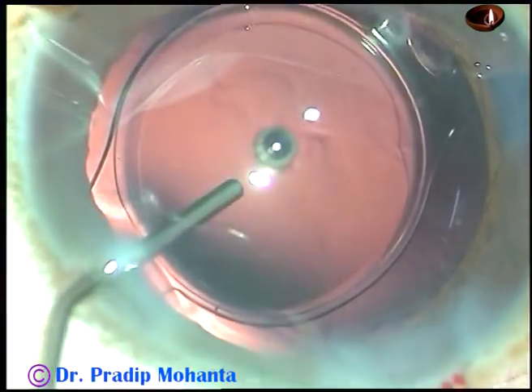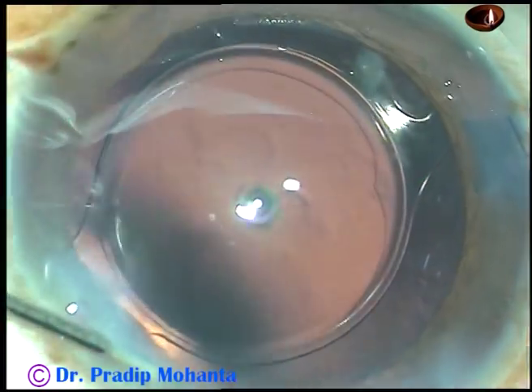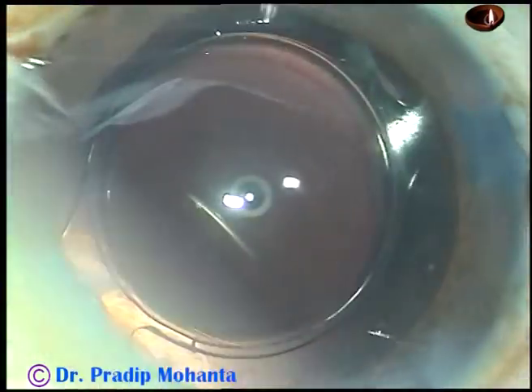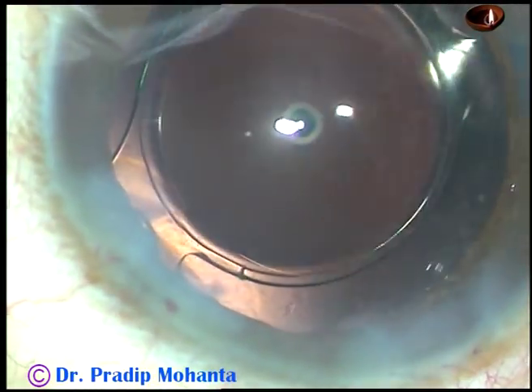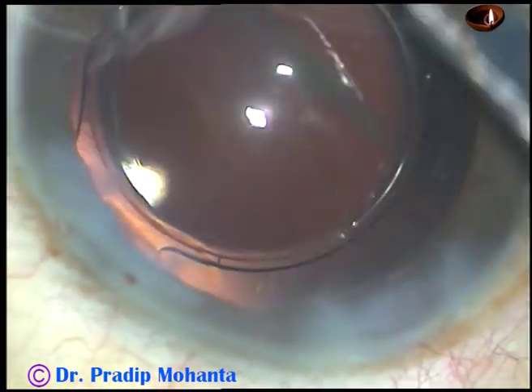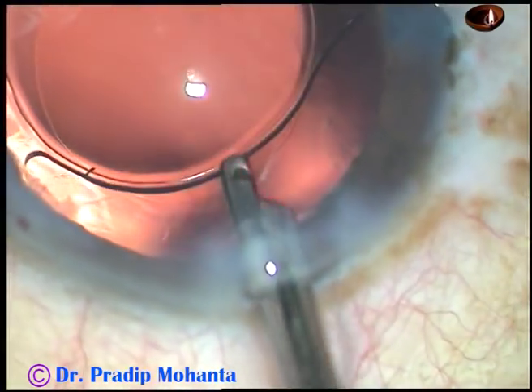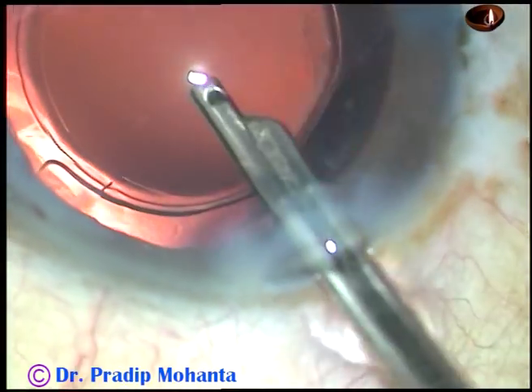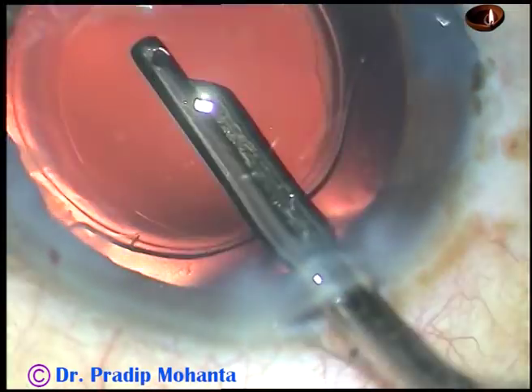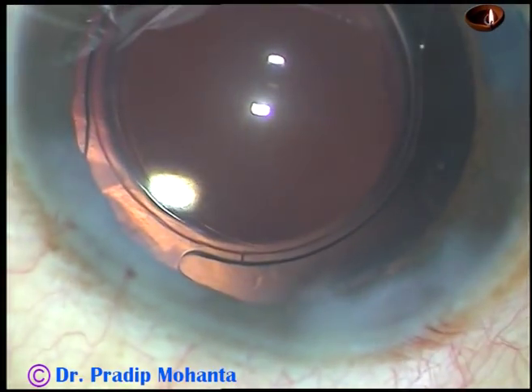Now it is said that in intumescent cataracts you need a femto laser to do rhexis. But if you raise your skills, if you develop astonishing, amazing surgical skills, do you need a femto laser? No. So instead of investing crores of rupees, please improve your surgical skills and manage difficult cases.